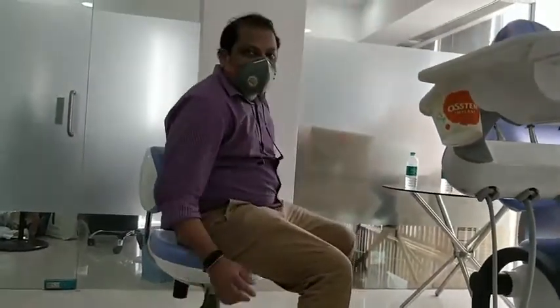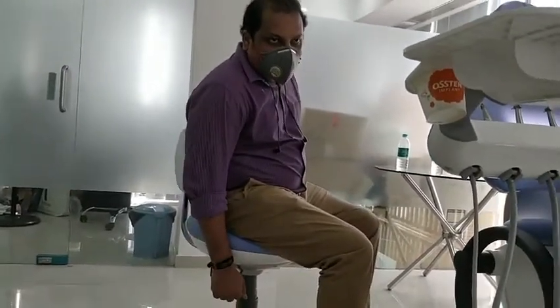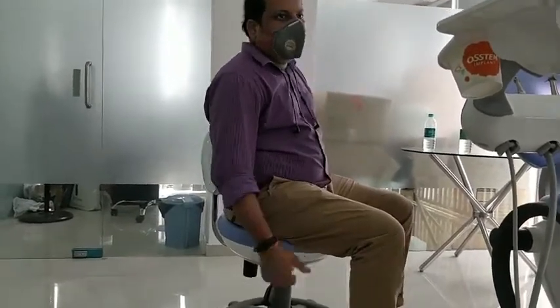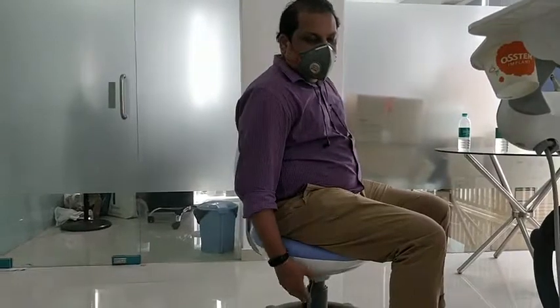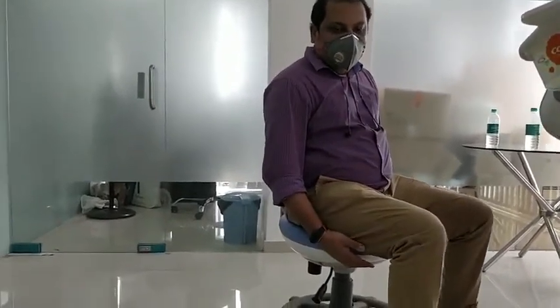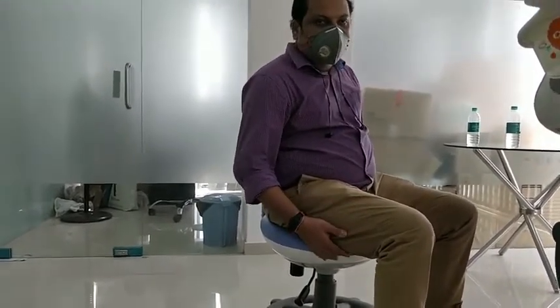There is a knob for adjusting the height of the stool as per the doctor's requirement. To increase the height, get up and press the knob so the seat rises. To lower it, give it a slight push. This ensures a proper ergonomic posture and helps maintain the body posture of the dentist while working.